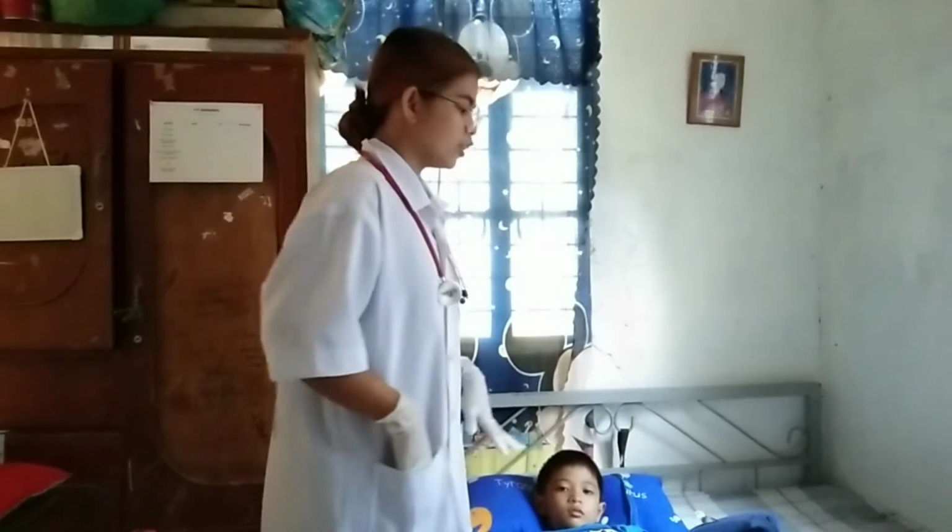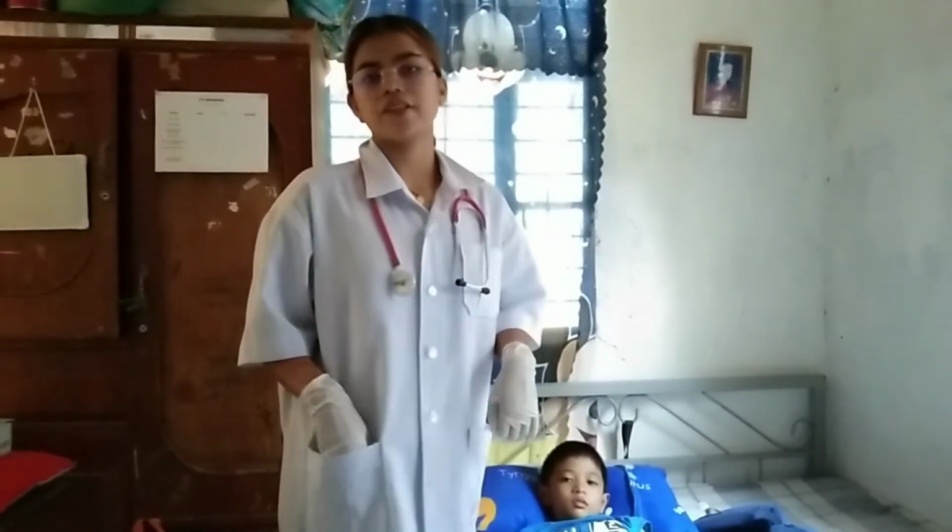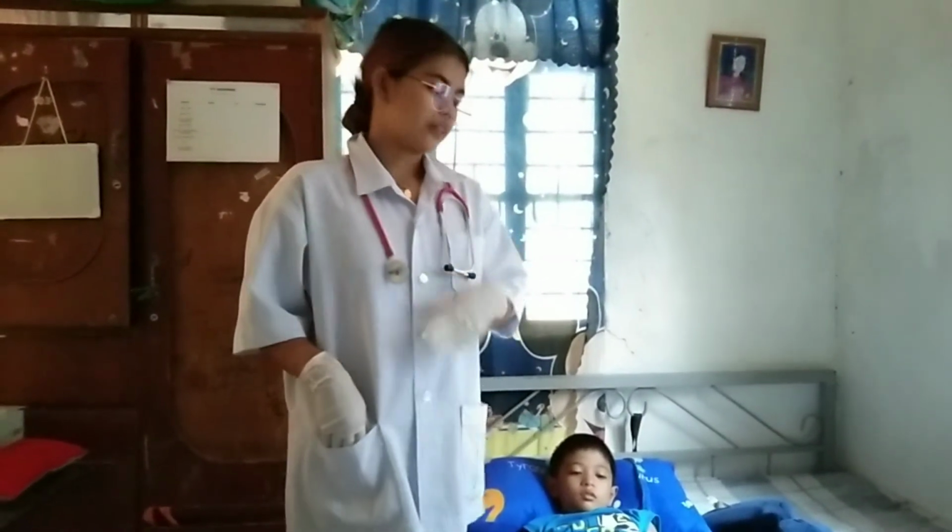So let me start. First, we're going to position the client in Sims' position, or the Sims lateral position, when doing the rectal temperature.